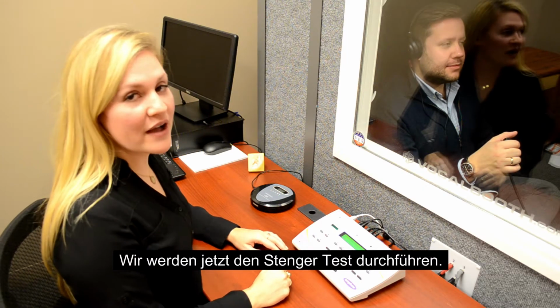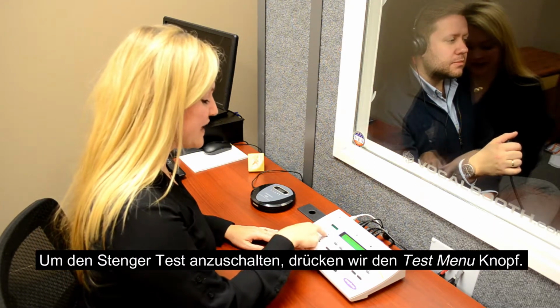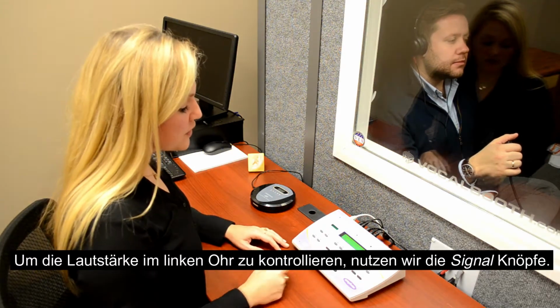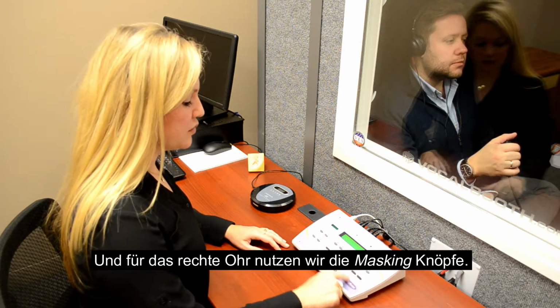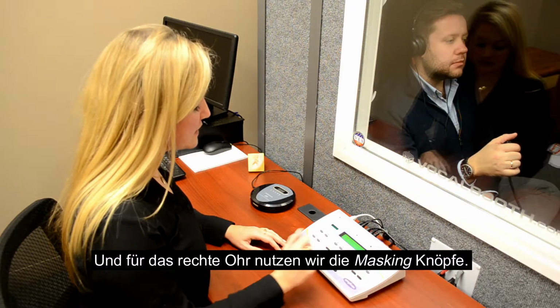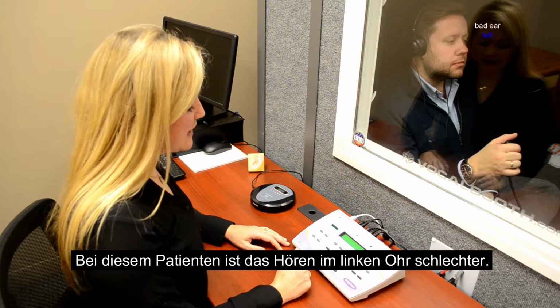So now we're going to go ahead and do the Stenger test. To get to the Stenger test, you press the test menu button. To control the left ear, you press the signal buttons, and to control the right ear, you press the masking buttons. So for this particular patient, his hearing is worse in the left ear.